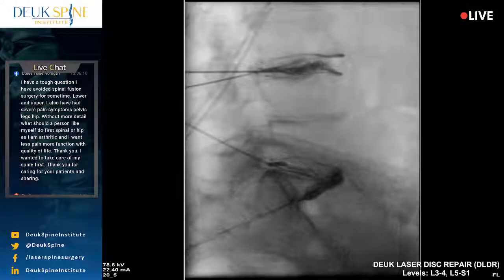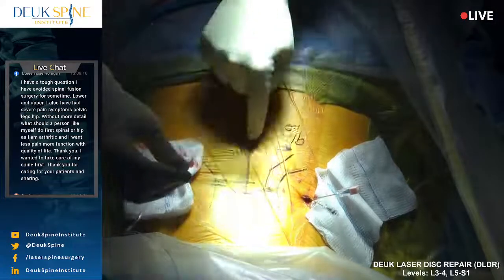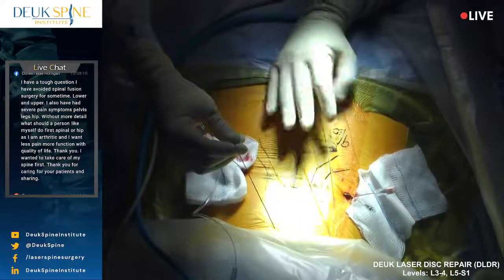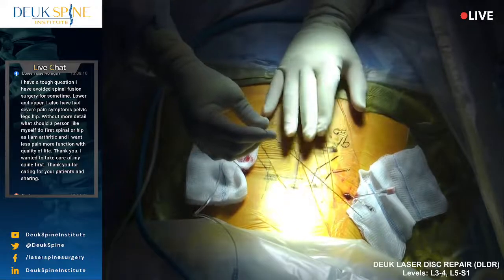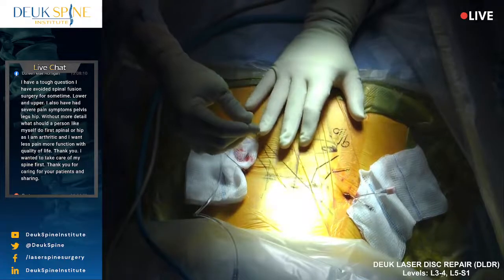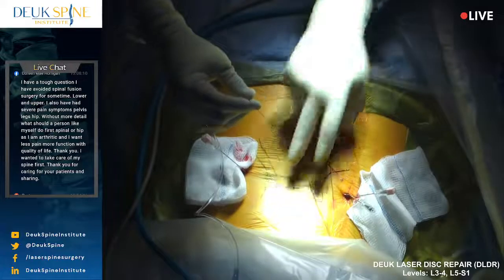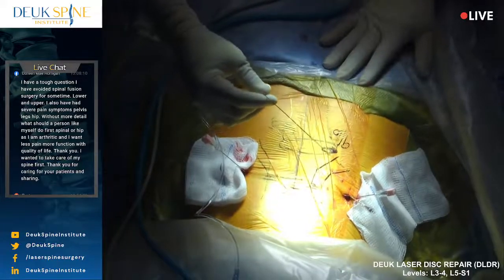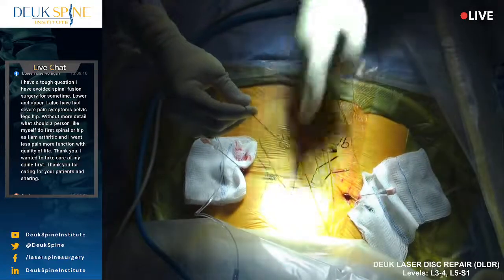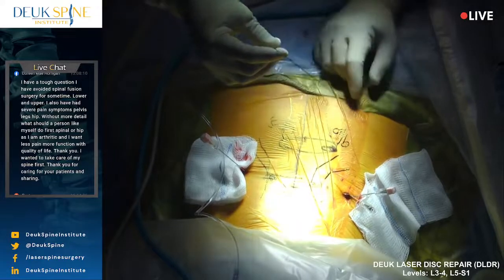So for those of you joining us now, we just tested the two discs we're going to be repairing today, and the bottom one was more painful for her. She called it a 9 out of 10 when I activated it with the discogram material. And so that disc is probably causing more of her pain than the one above, which is L3-4. But the L3-4 is pinching the nerves worse. So the leg symptoms are coming mostly from L3-4. The back pain is coming more from L5-S1. We're going to fix both, so it should take care of the back pain and the leg symptoms.